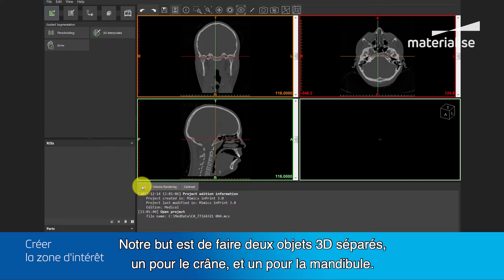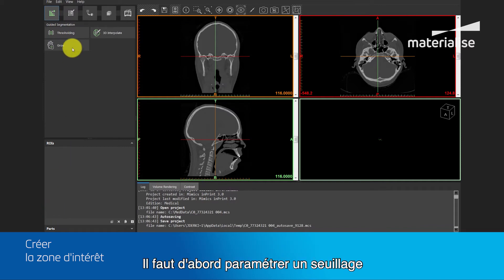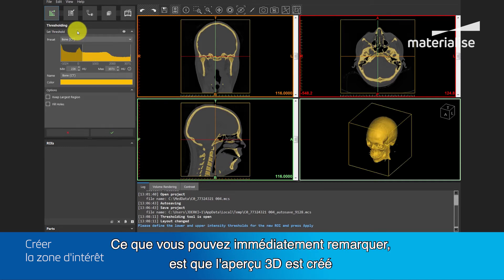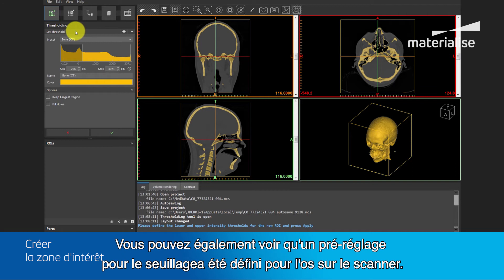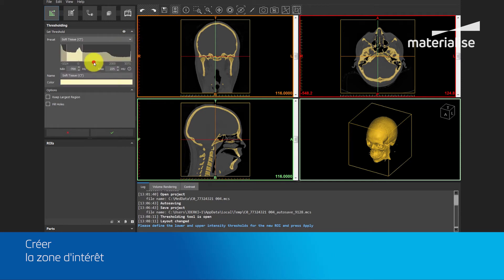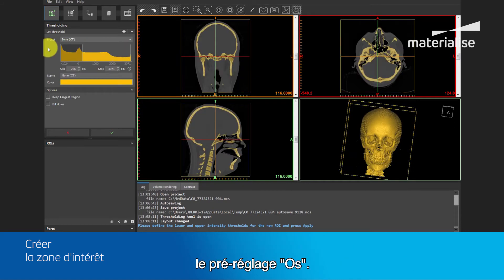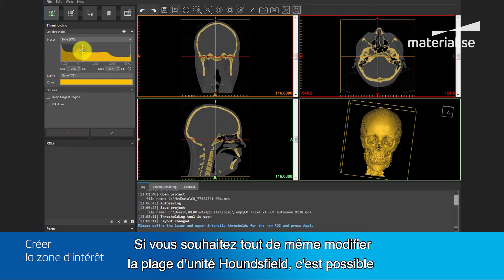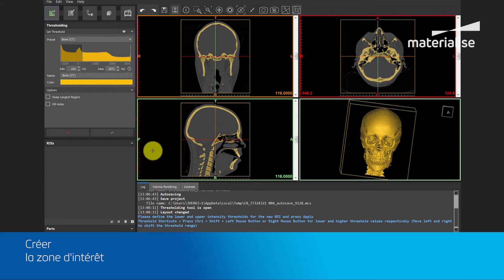Our aim is to make two separated 3D parts, one of the cranium and one of the mandible, which we can use afterwards for further surgical planning. The first step is creating the region of interest by setting a threshold. You can notice the 3D preview image created in the lower left viewport, which is not yet a 3D model. A preset has been set on Bone. If you still want to tweak manually the Hounsfield range, this is possible by moving the sliders. If you also like to exclude certain structures, you can use the crop box to crop the region of interest.